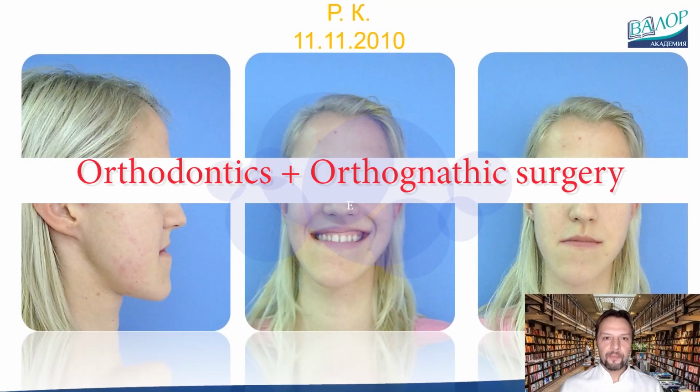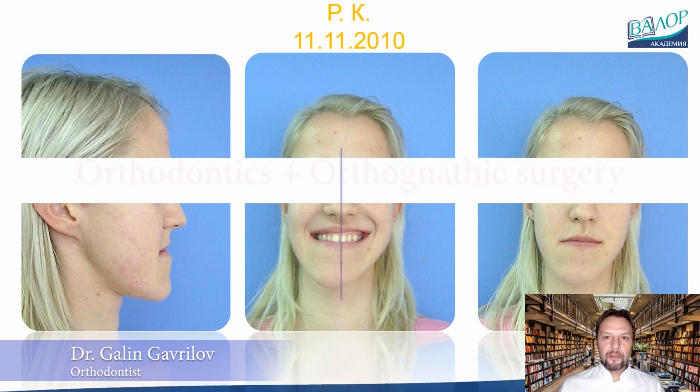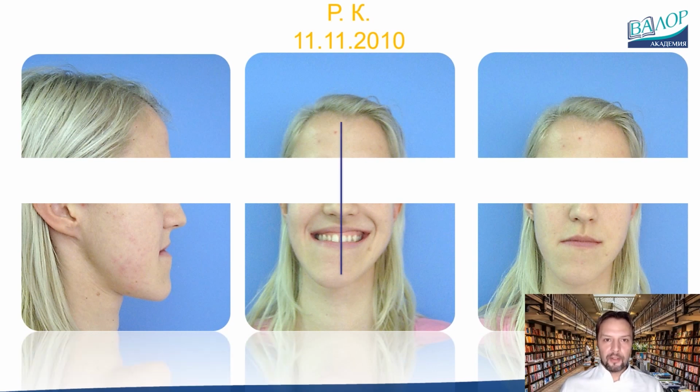Dear colleagues, the next episode in our series about planning and carrying out an orthodontic treatment is about the easiest for diagnostics but most complicated for execution approach to Class 3 treatments, orthodontic-surgical treatment. In this case we will begin with an orthodontic treatment and a little bit before its end, an orthognathic surgery for correction of the jaw's relationship and the asymmetry.